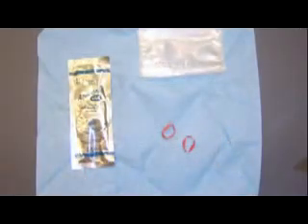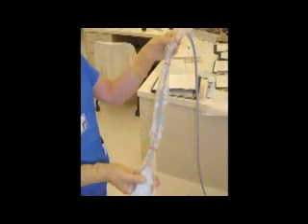A sterile glove can be used as a probe cover during central line placement, but it is best to use a commercially available sterile probe cover. Sterile probe cover kits contain a long plastic sleeve, sterile gel, and small rubber bands to secure the sleeve. To apply the sterile probe cover, have an assistant place non-sterile gel inside the sleeve and then place the probe into the sleeve, pulling the sleeve over the probe and cord. Place the rubber bands to hold the cover in place. Place some sterile gel on the tip of the probe once the sterile cover is in place.